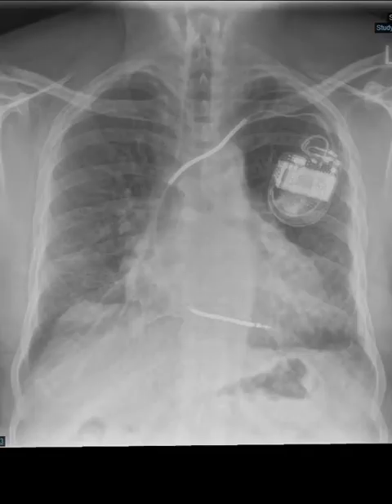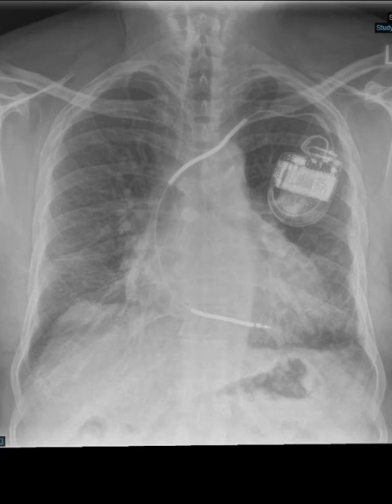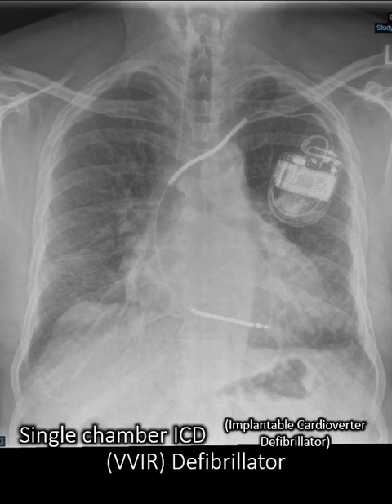This time we have a single lead and we have two thick coils visible. This therefore is a single chamber ICD.